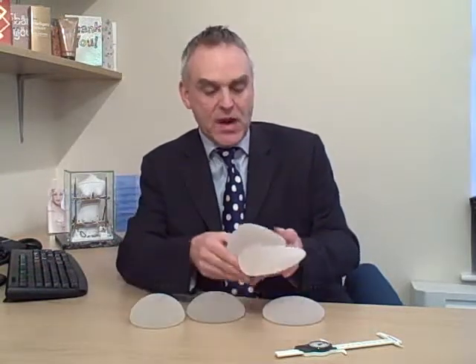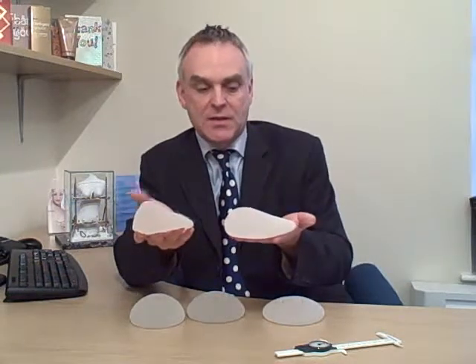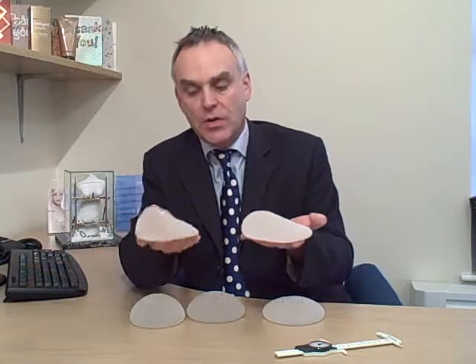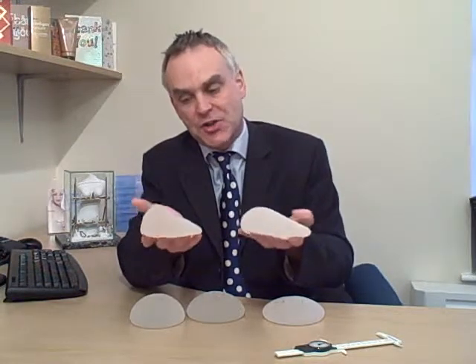And again, it's very similar with shaped implants. Remember, if they've got under 2 centimetres of pinch in the upper part of the breast, we tend to think shaped implants because we want to create the natural appearance of the breast. And again, you can either go for a low projection shaped implant, this is the top bit, flat here, shaped here, or you can go for a much higher projection, a much shorter height, higher projection.